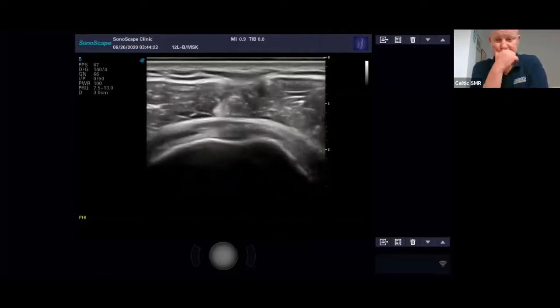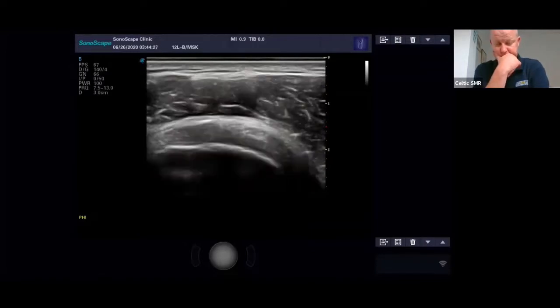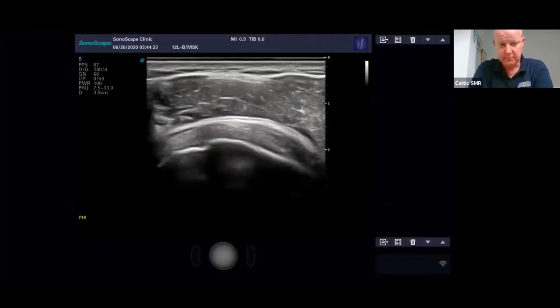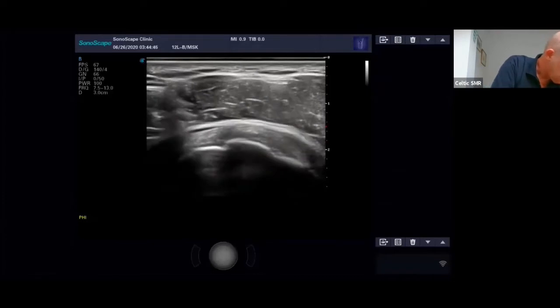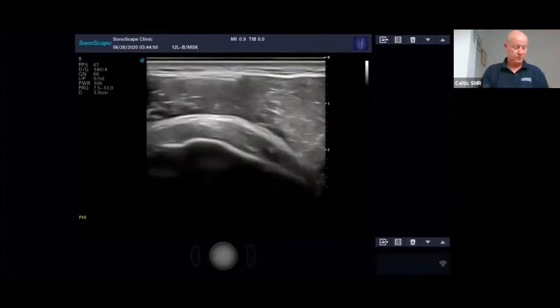The other way you might use it, not necessarily for the shoulder, is for synovitis around joints, things like that. You need to be fully versed with your Doppler settings though, because that is key. Make sure you take your Doppler settings right down to pick up the low flow. If you've got it set too high, you won't pick up anything, and you might just have a false negative there.